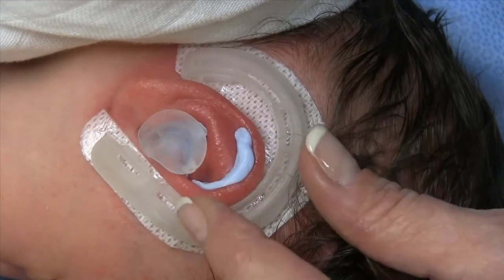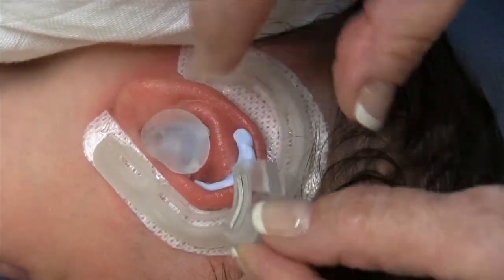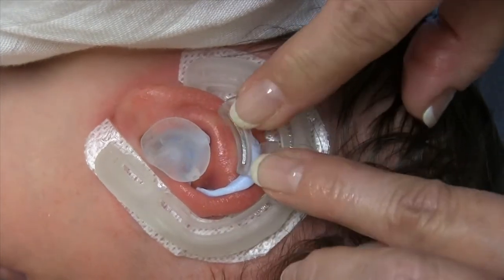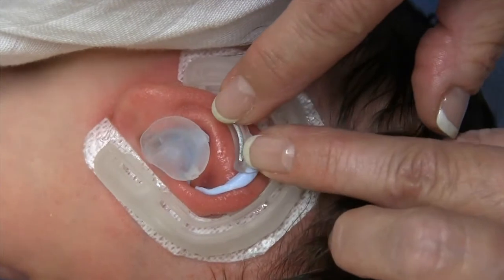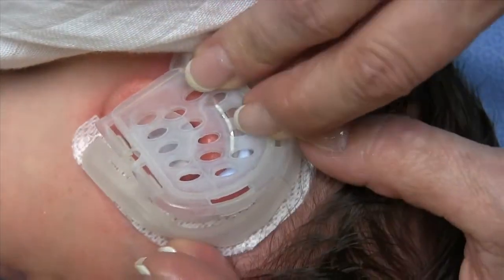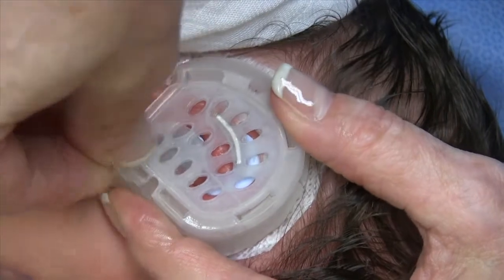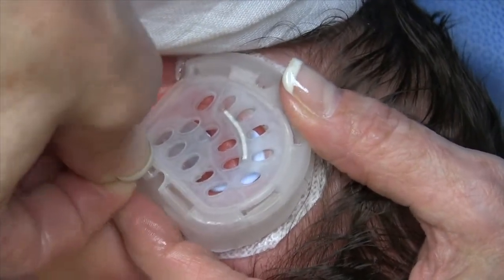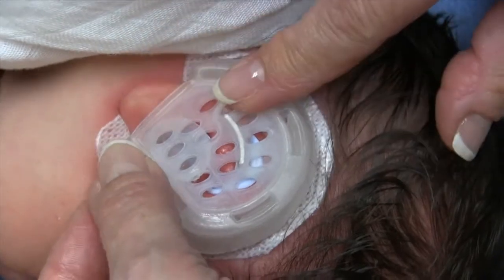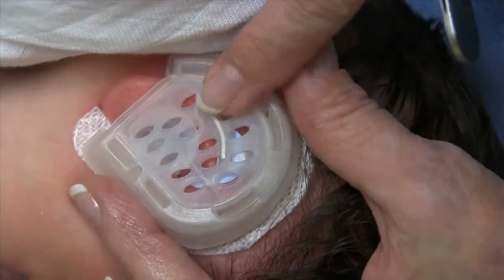That's starting to set up a little bit — I'm going to bring that around. This is nicely set, so we're going to put that retractor in place. That's well seated. And then we put our anterior cradle right here, and that's it.